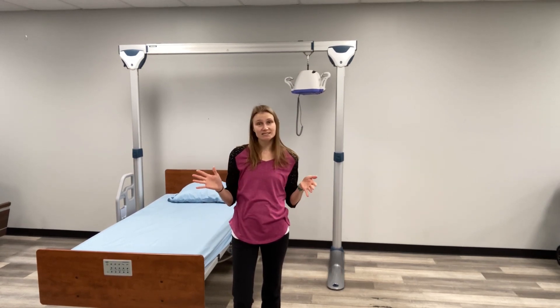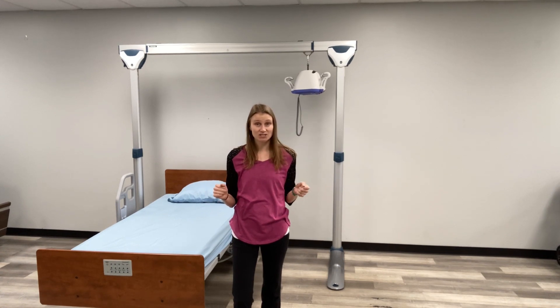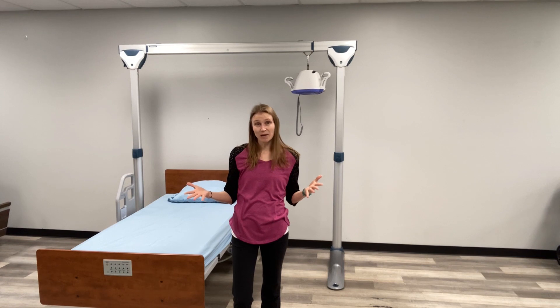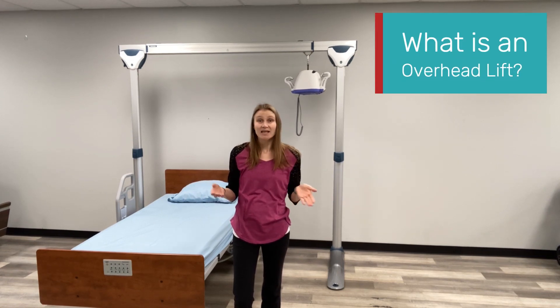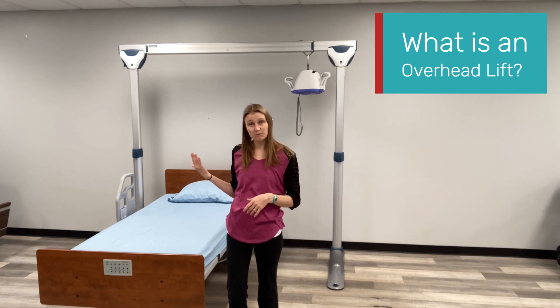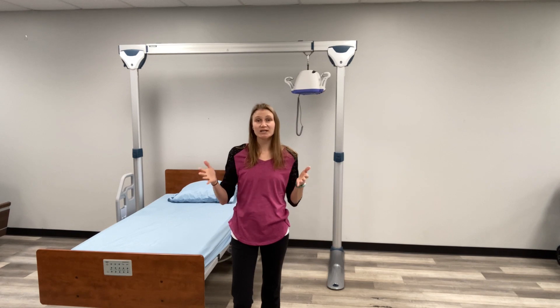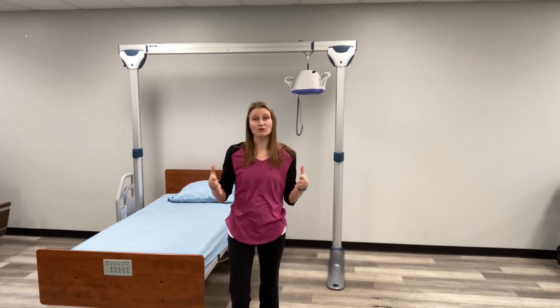We have already discussed the most common two types of patient lifts, which are Hoyer lifts and sit-to-stands. There is another option called an overhead lift. The lift behind me is one type of overhead lift. This is a freestanding unit, but the concept of overhead lifts is there is no system to drive.